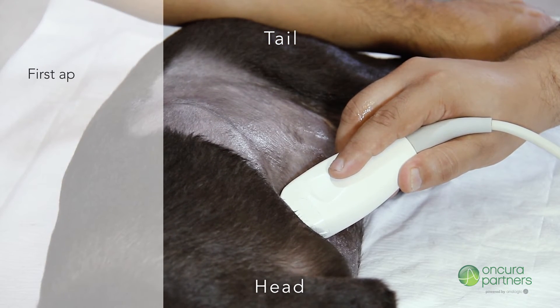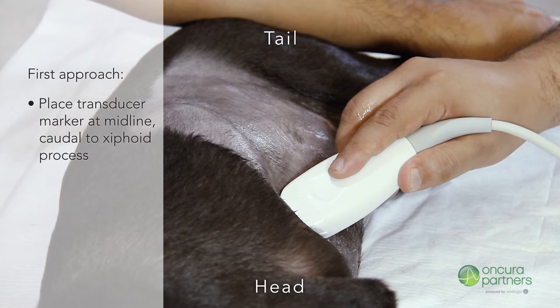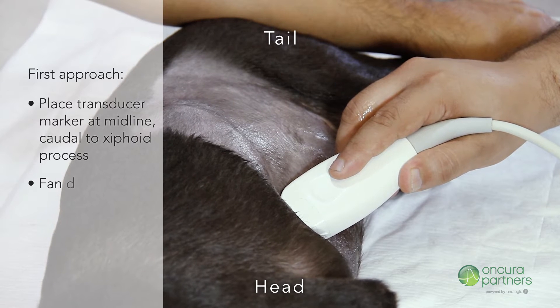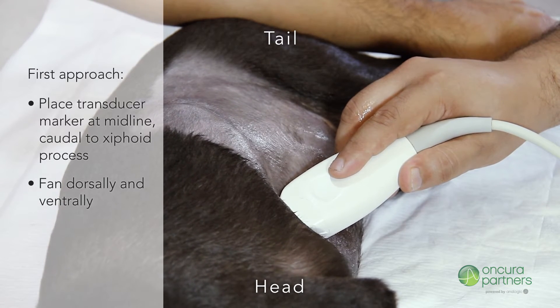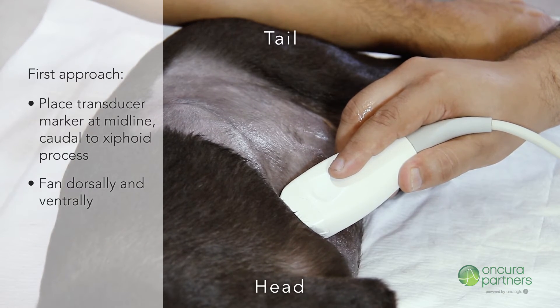In the first approach, place the transducer marker at the midline, caudal to the xiphoid process. The sonographer can then fan dorsally and ventrally to assess the left and right sides of the liver while taking videos.